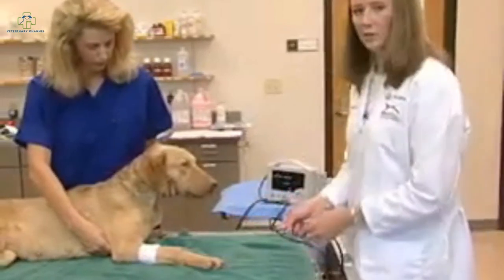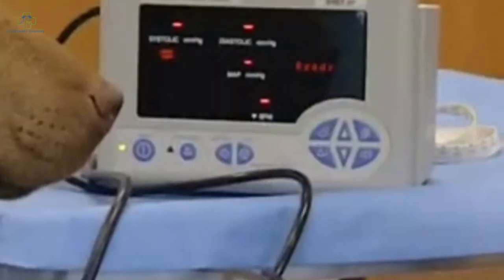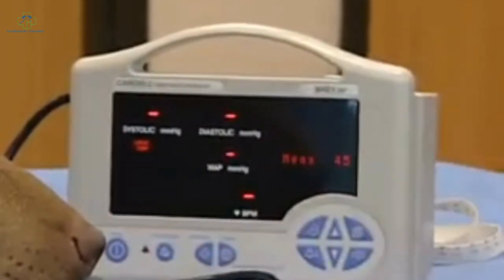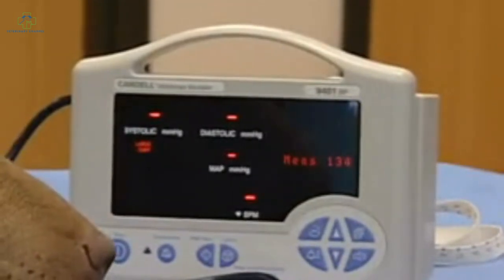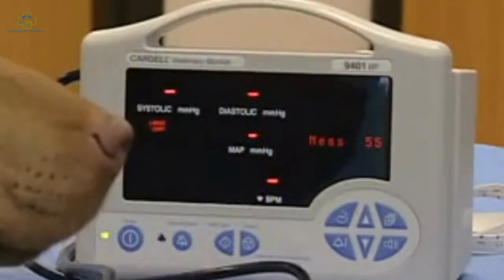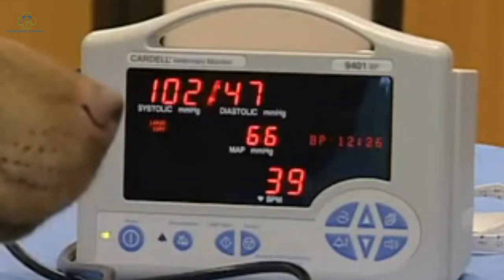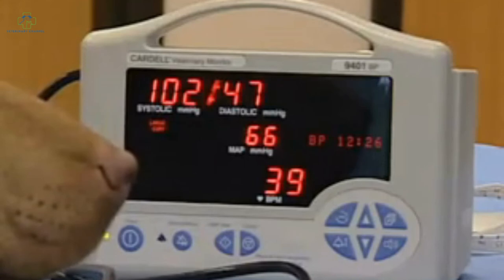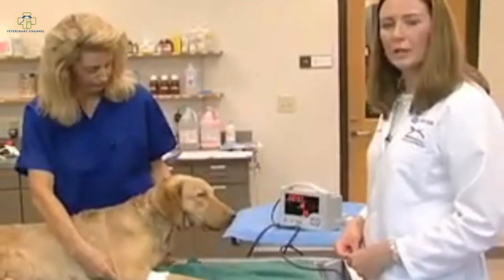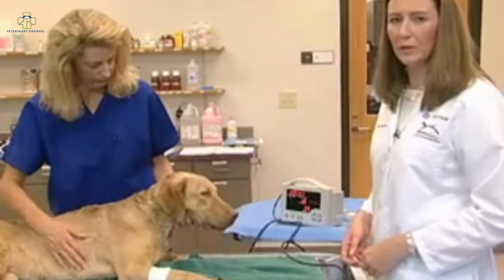We then connect the oscillometric machine and initiate the readings. It does take a period of time for the oscillometric machine to obtain its readings, but it does manage to obtain systolic, diastolic, and mean blood pressures. As you can see, we've been able to record some results — the systolic, diastolic, and mean arterial pressure. As with the Doppler method, it's important to take a number of readings and average those, and again record all measurements along with the cuff size and location in the medical record.